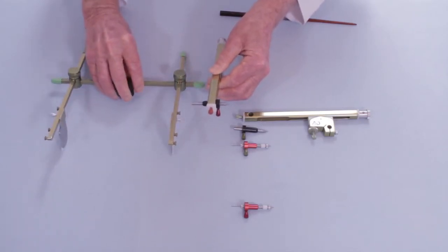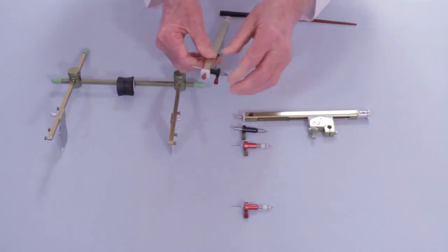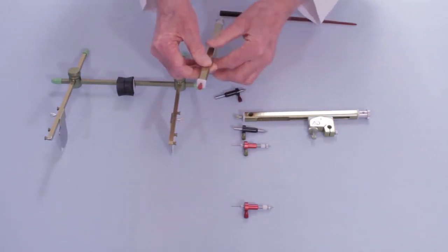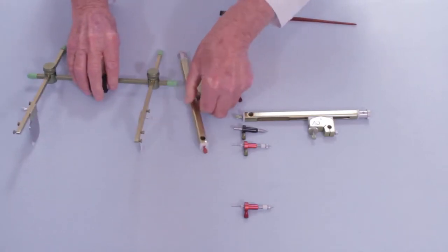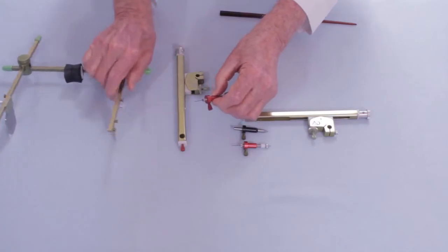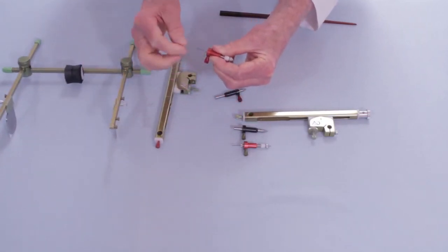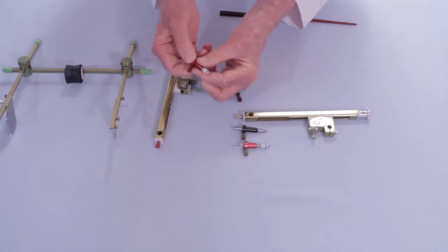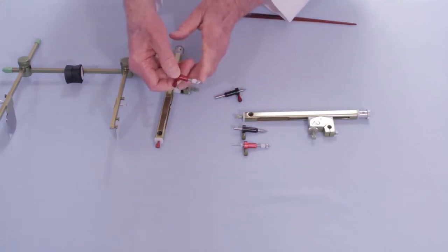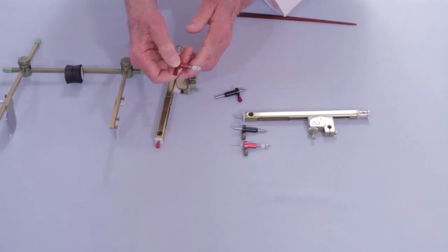But the important thing is I want to show you the importance of establishing that distance. Now I'm going to use the writing pencil to show you how the writing pencil works and why that distance is important. The writing pencil, we've already preloaded the lead, and you may remember the easiest way to do this is to load the lead from the back. You have a very small part pointing out here. You can use a fine piece of sandpaper to sharpen the point a little, or a scalpel.